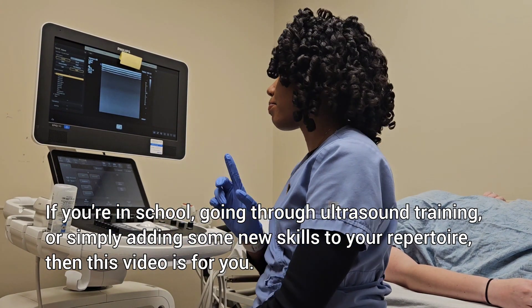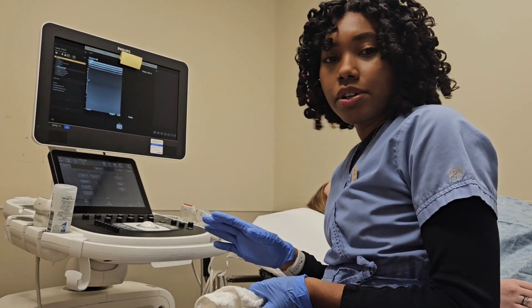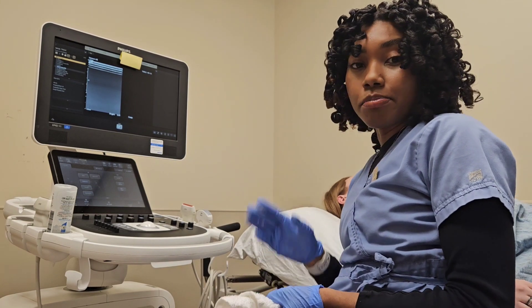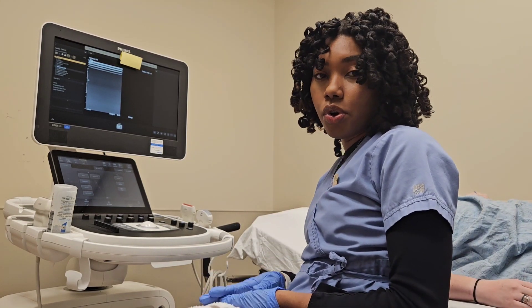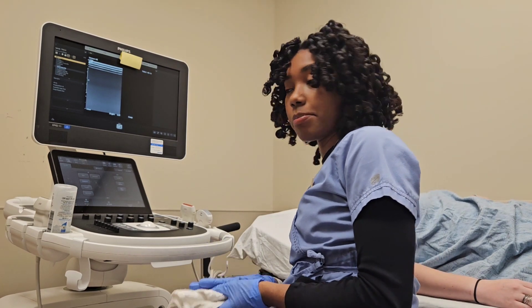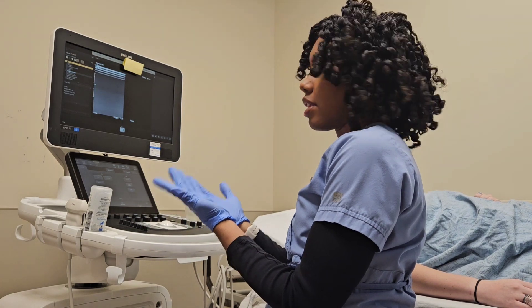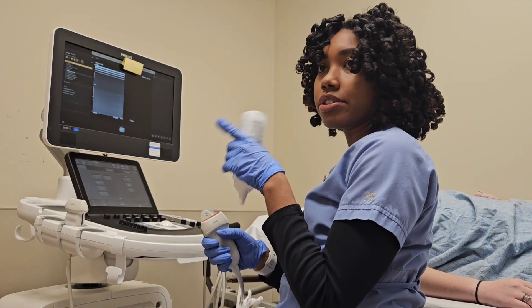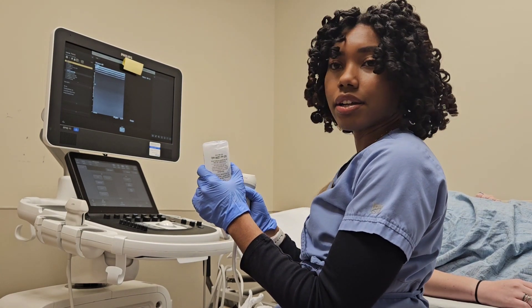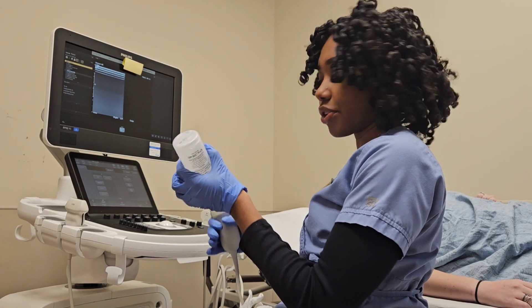I created a protocol that we're going to use for this. First I start with the internal jugular vein. We're checking for blood clots in the deep veins or in the superficial veins to see if this would be superficial venous thrombophlebitis. I usually have the patient supine — if they're a little bit elevated that's good. For the internal jugular vein I usually get them to look straight ahead. If they strain their head or turn it one way or another it's a little bit more difficult to compress.